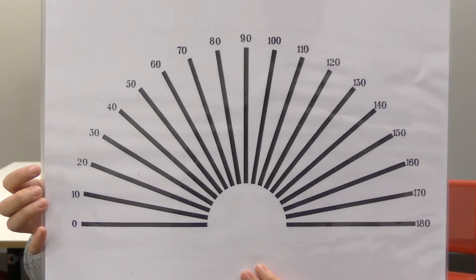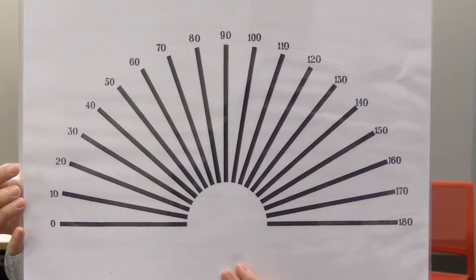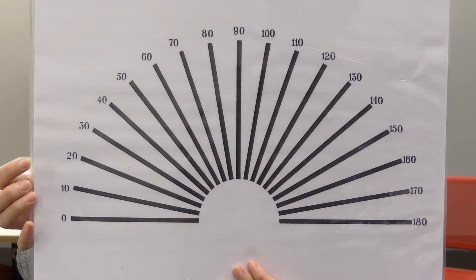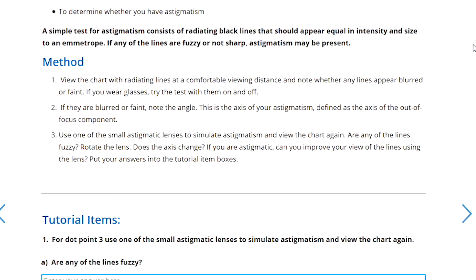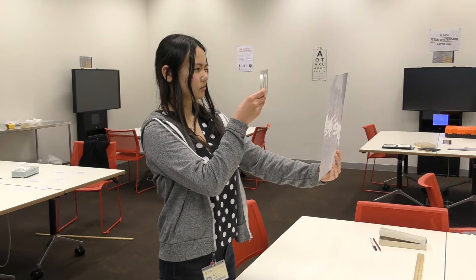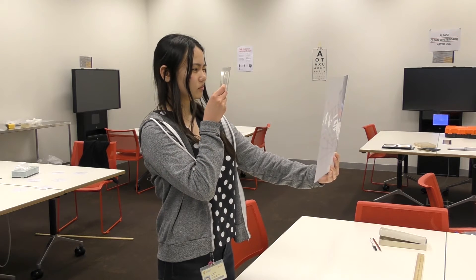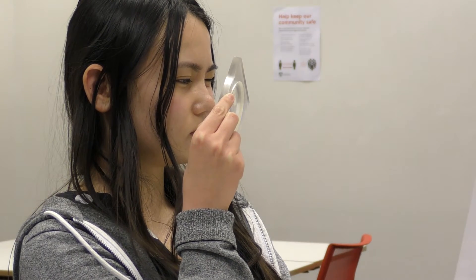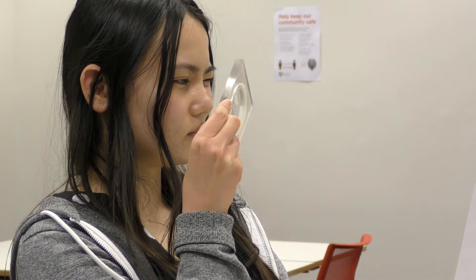For a normal sighted person all the lines will appear in focus and so to simulate astigmatism we'll use a special lens that has an irregular curvature. Following step 3 in the instructions, look at the chart using the lens. Are any of the lines fuzzy or out of focus? In which case make a note of the angle. Then rotate the lens and see whether the axis of out of focus lines change.